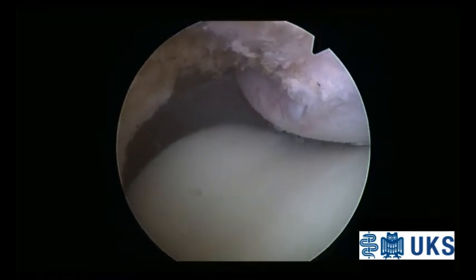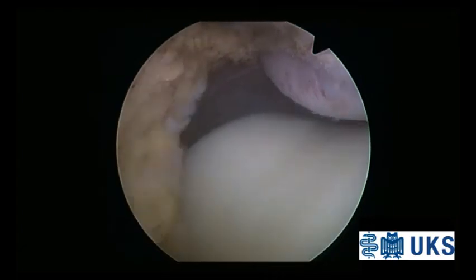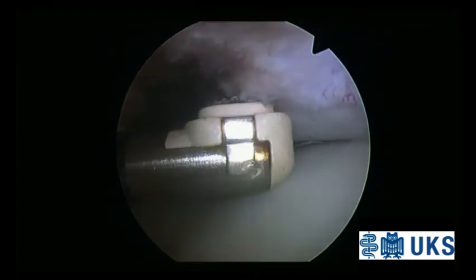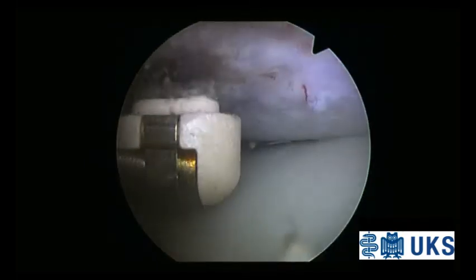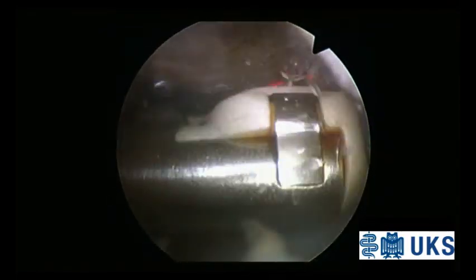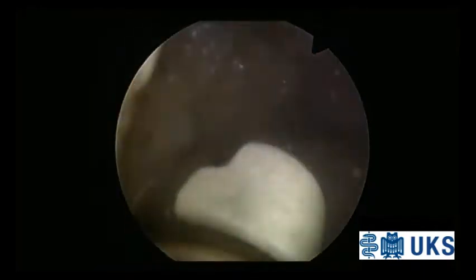After diagnostic arthroscopy using a high anterolateral standard portal, an anteromedial accessory portal beneath the patella next to the patellar tendon is created. Pathologically inflamed soft tissue is resected, and a careful partial resection of the Hoffa fat pad is performed using a synovial resector and an electrocautery device, preserving the main fibers of the patellar tendon.